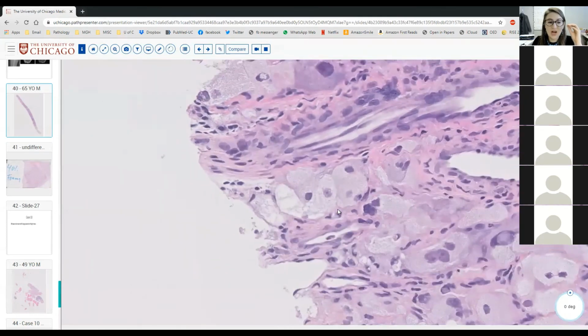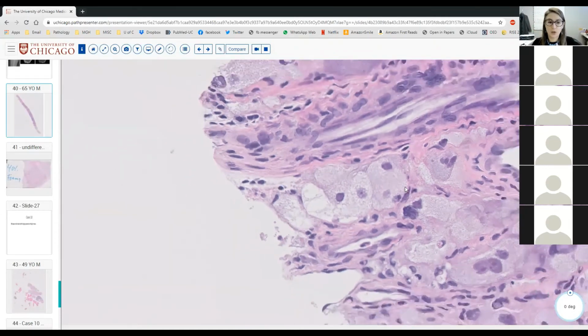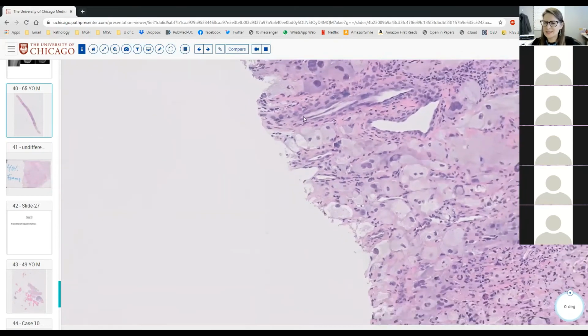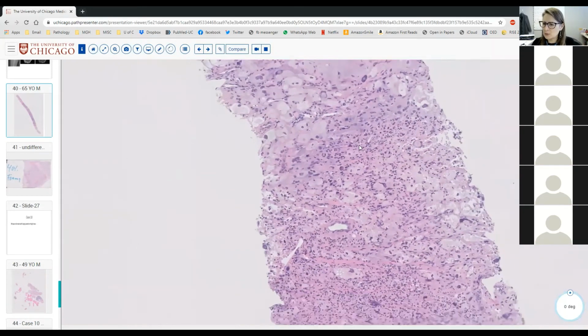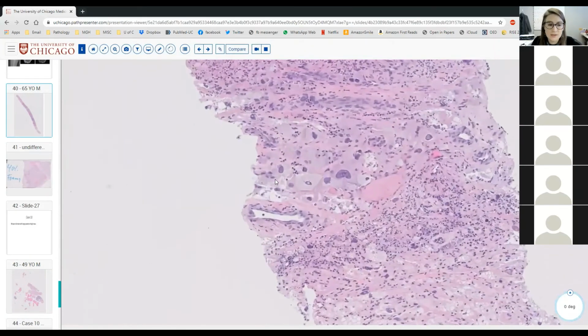This type of picture, I'm not saying that this is what this is at all, but this type of morphology with the nucleus being round and plump and not indented is also what you see, and I think somebody mentioned it, in brown fat. So brown fat also has small vacuoles and the nucleus is not indented, okay? I don't think this is brown fat, and there really isn't a great brown fat malignant equivalent. So I think these are just foamy tumor cells. And so, like we said, a foam cell or balloon cell melanoma, S100, SOX10.